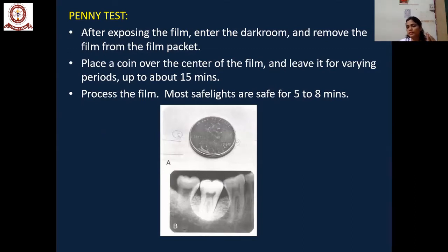Generally, the filtered safe lights with the GBX2 have a minimum of 5 to 8 minutes of safe light capacity. If you keep a coin over the exposed film and wait for 5 minutes, and if you can see the image of the coin after processing the film, even before 5 minutes, then the GBX2 filter is not safe.